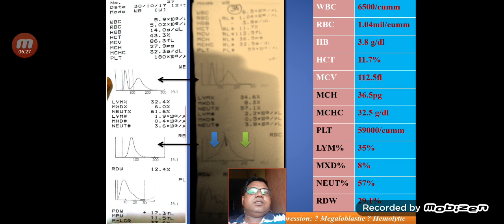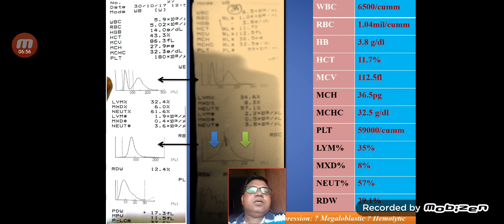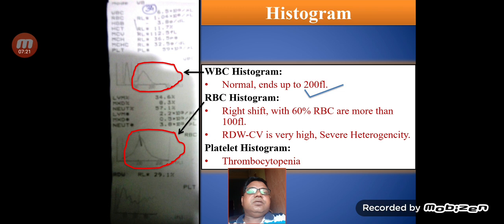In case number two, the RBC histogram is widened. The MCV of this patient is 112.5 femtolitres and the RDW is around 29.1%. However, analyzing the WBC histogram, we can see the curve ends around 200 femtolitres. When the WBC curve ends around 200 to 250 femtolitres, we can say this is a case of hemolytic anemia. The WBC curve is normal, ending at around 200 femtolitres, while the RBC histogram is totally shifted towards the right with high RDW-CV.